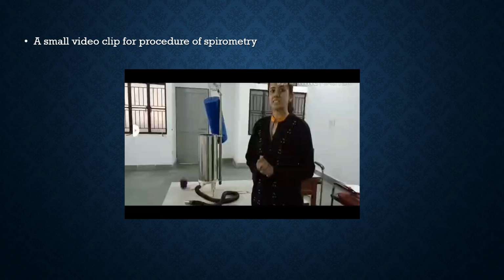Then he is asked to inspire as deeply and fully as possible. The nostrils should be kept closed with a nose clip or with the thumb and index finger. Then we have to take 3 recordings at intervals of 5 minutes, and the maximum volume of the 3 readings should be considered as the reporting value. So now see the video.